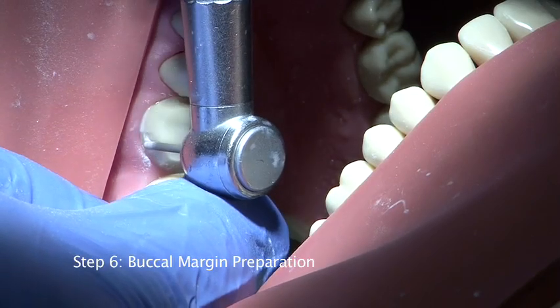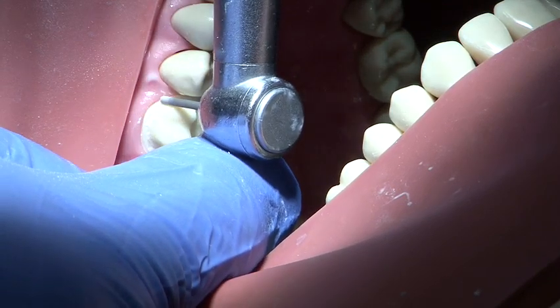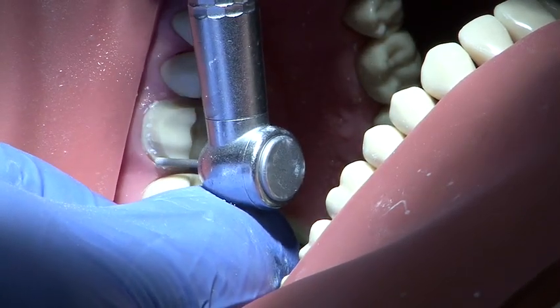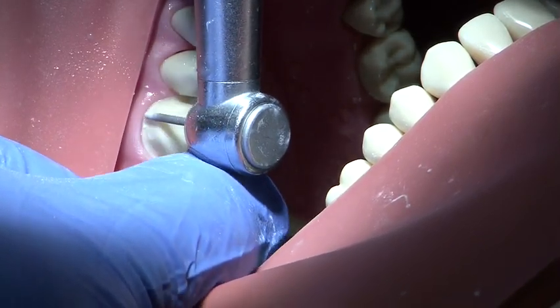The buccal surface and margin is prepared to a depth of 0.5 to 1 millimetres. A chamfer margin is achieved using a parallel sided round ended medium grit burr, and a smooth action with the handpiece supported by the free hand at all times ensures that the margin is prepared as smoothly as possible.